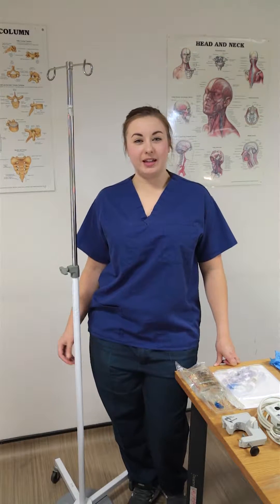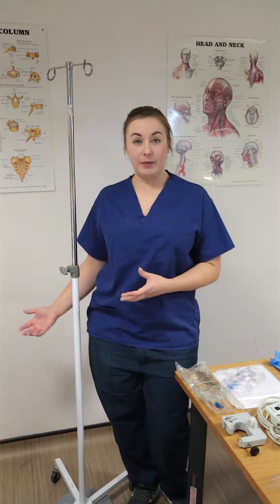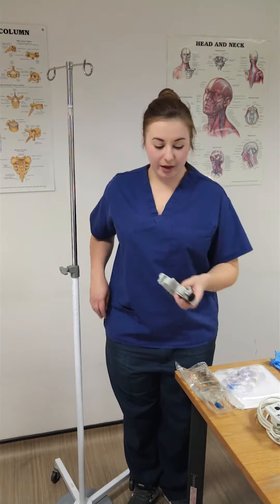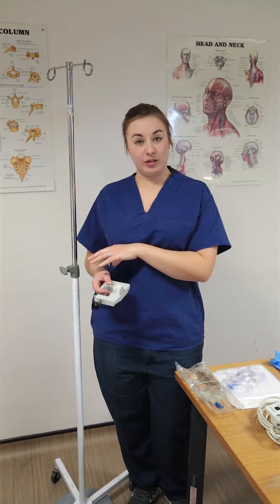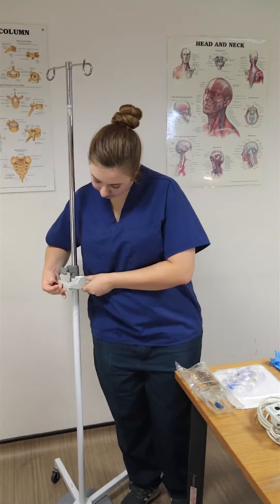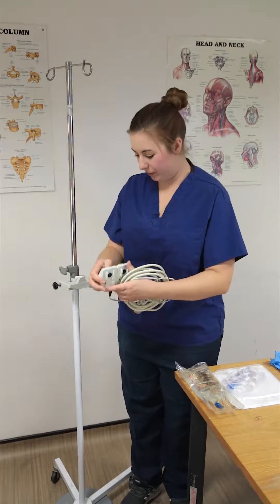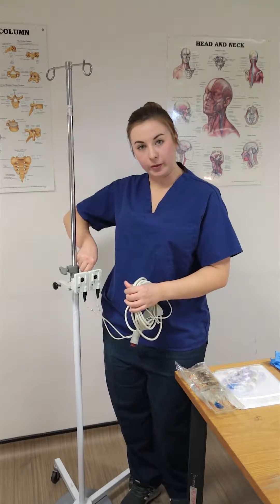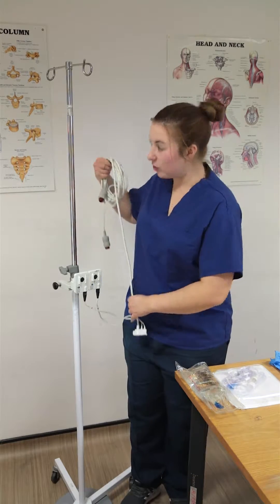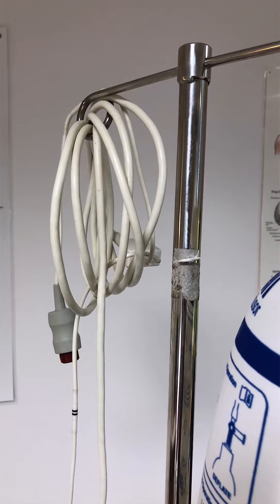The nurse's role in setting up the arterial line, after you've got your kit ready, is to prime the line itself and make sure the transducer cables are ready. The first thing I will start with is making sure my transducer cables are on my drip stand — my halter and then my cables themselves, which just have simple little twist locks at the back. I then hook all my lines onto one of my drip hooks so they're out of the way.